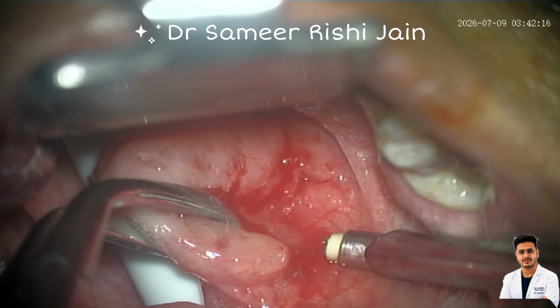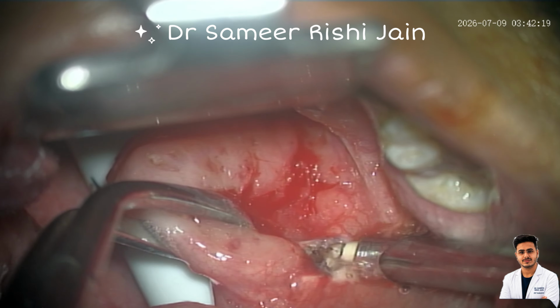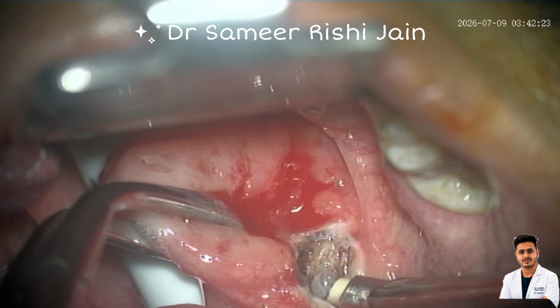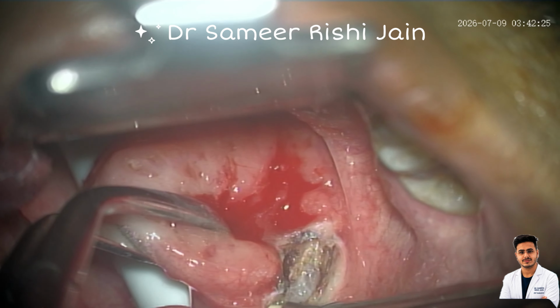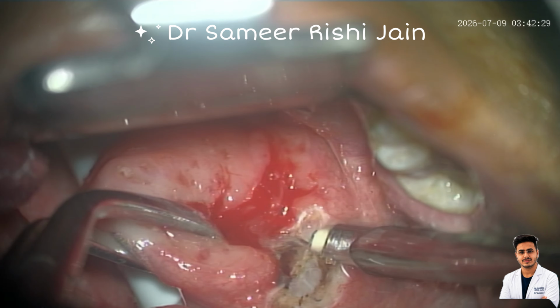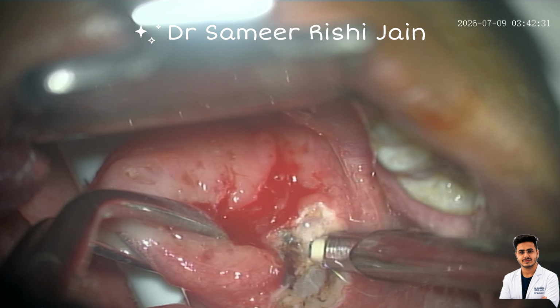This is a case of Coblation Tonsillectomy of the right side. We are using EVAC 70 by Smith and Nephew plasma wand. We are using the wand at a setting of 7 for ablation and 3 for coagulation.